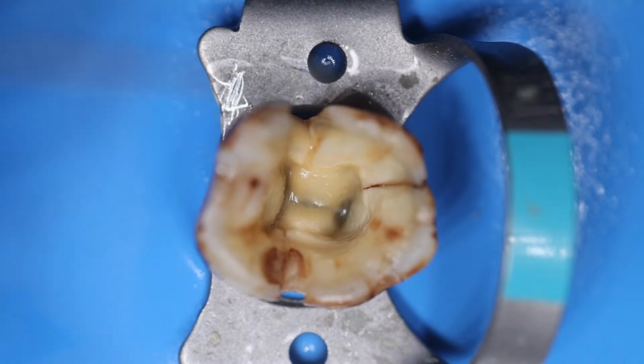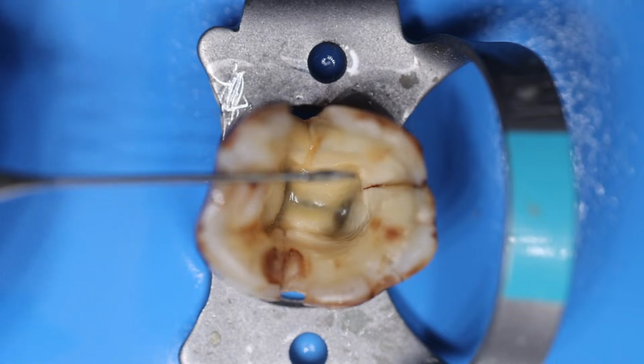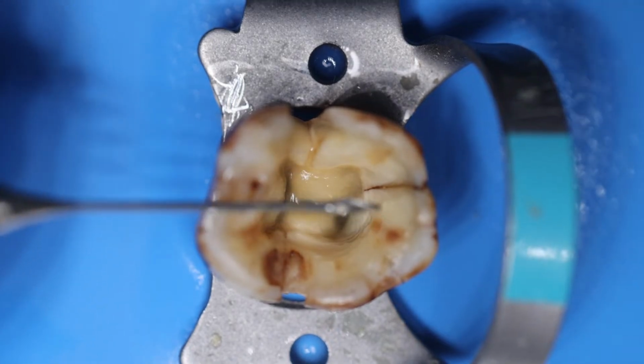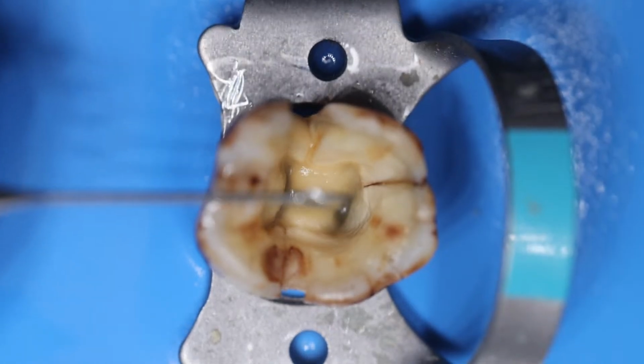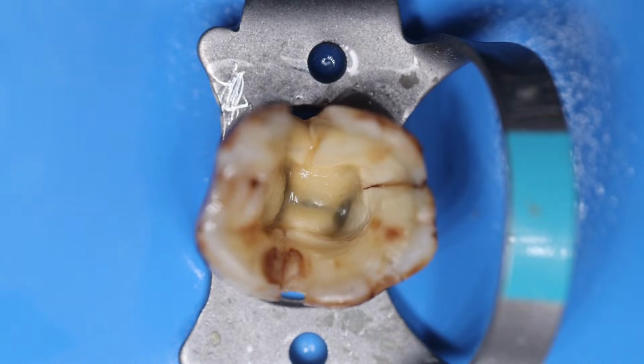So this is the GG drill, and there are different sizes of these GG drills. Just look at that GG drill, as you can see over here. You can use the GG drills to enlarge the canals. So what we are doing now is we are just switching on to the GG drills over here.